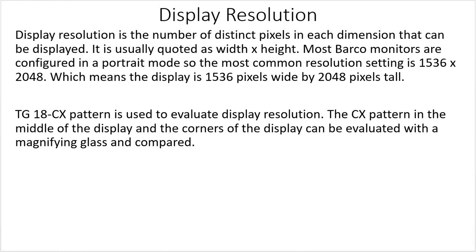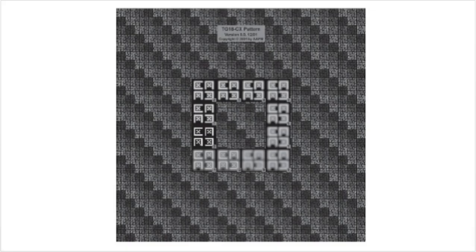TG18CX pattern is used to evaluate display resolution. The CX pattern in the middle of the display and the corners of the display can be evaluated with a magnifying glass and compared. Okay, so I'm not going to pull out a magnifying glass and try to count all the pixels in here, but if you look in the center square and you compare the corners, you should get about the same number of pixels, and it should look roughly the same. That's how you do display resolution.